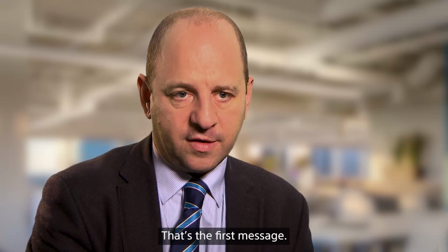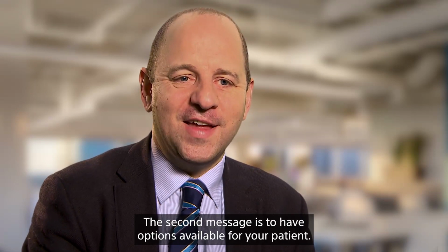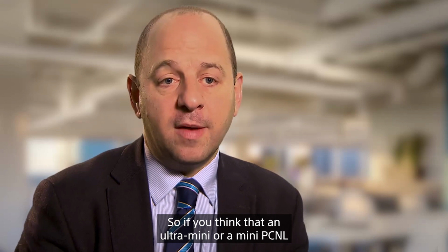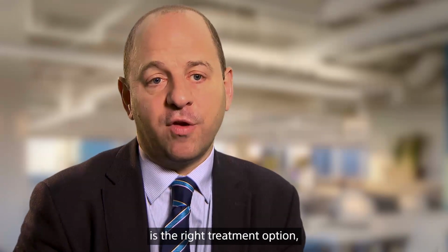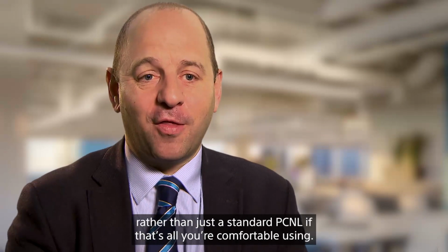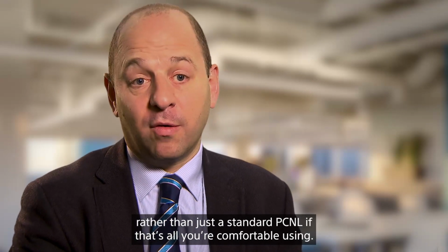That's the first message. The second message is to have options available for your patient. So if you think that an ultra mini or a mini PCNL is the right treatment option, then that's the thing that you should be able to use rather than just a standard PCNL if that's all you're comfortable using.